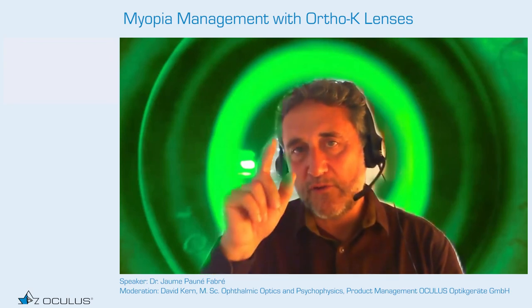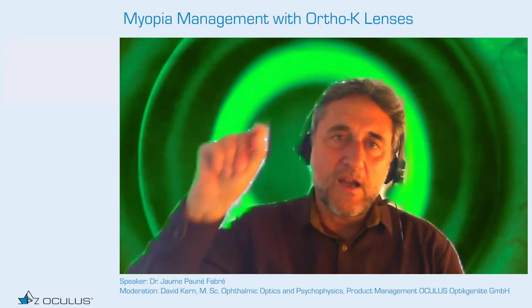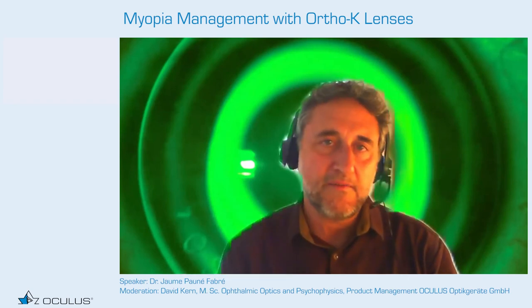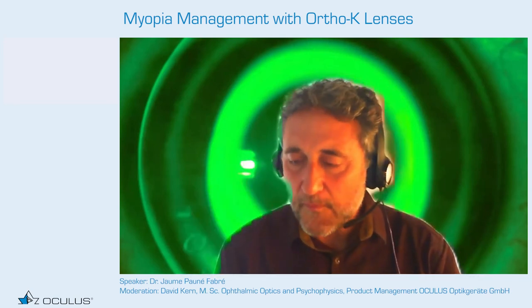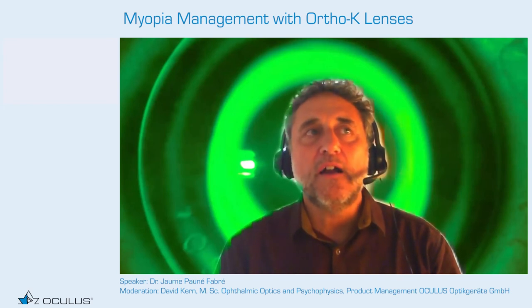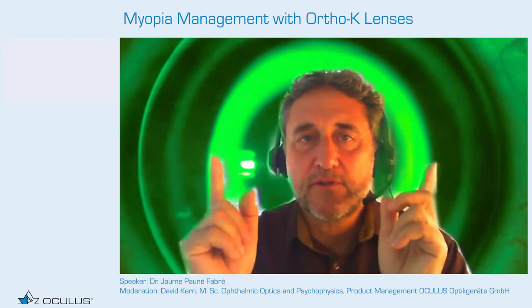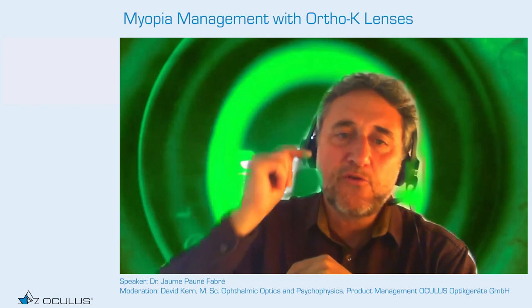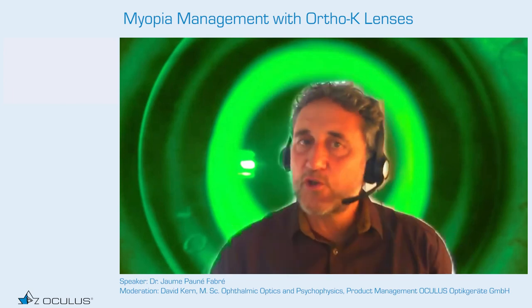The problem is, when you click there, you will have a local point. This is not the average point. The average value is something some topographers provide and some don't. If you have an average, it's better, but point to point is difficult. Another point is that in my study, we measured that it is relevant in horizontal, so probably it's relevant in horizontal nasal-temporal points, but not relevant in vertical. So we need to look at which side is more important, maybe nasal, but we are not sure at the moment.